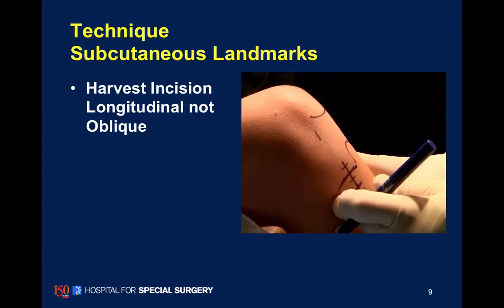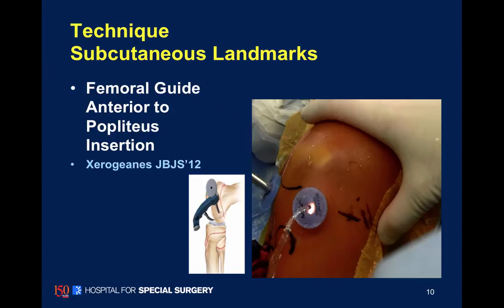We use a longitudinal incision along the anteromedial aspect of the knee to harvest our hamstring tendons. We place arthroscopic portals within the knee to facilitate suture passing, suture management, and graft passing.